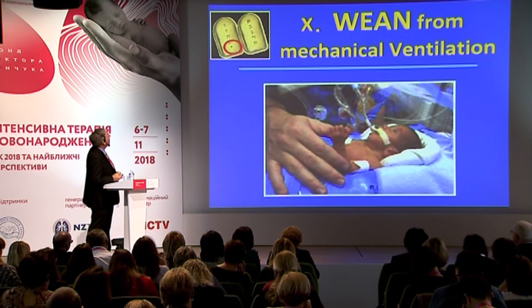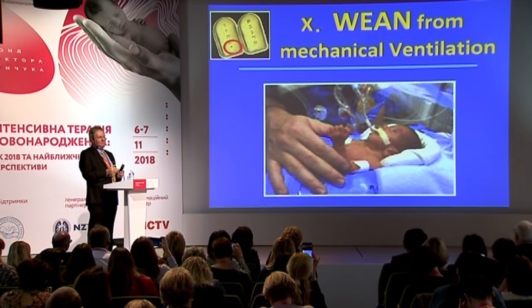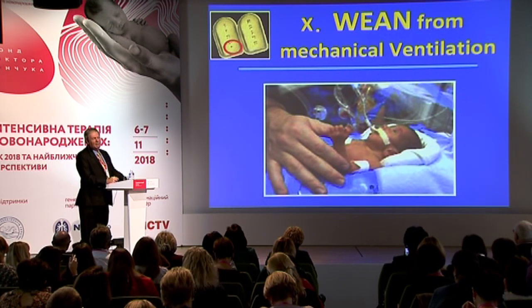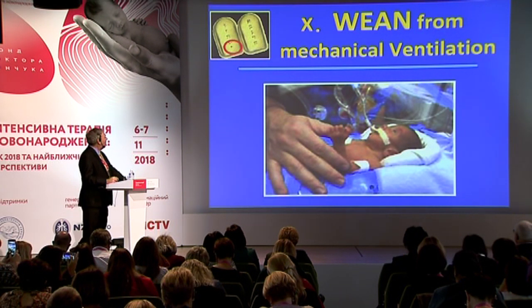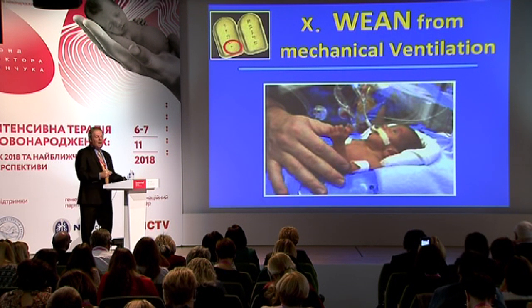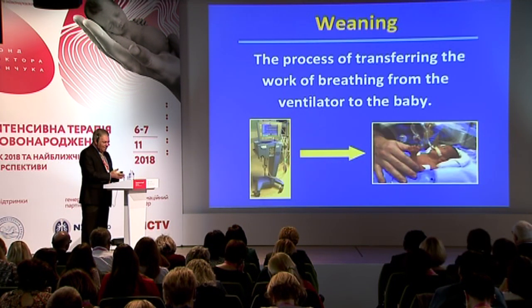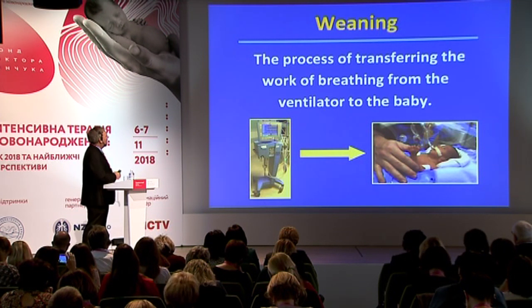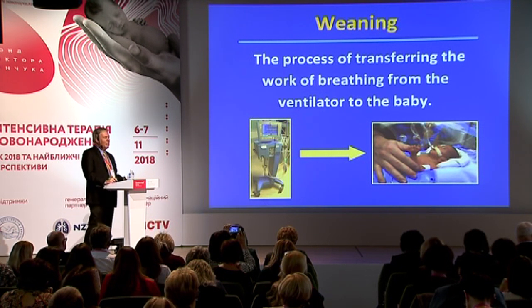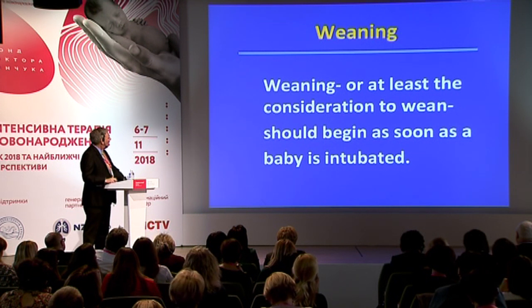And finally, the last commandment, wean from mechanical ventilation. I think all too often we get too complacent. We put the baby on the ventilator, things are going really well, and we're very reluctant to want to decrease the level of support. But if you think about weaning, what is weaning? It's a process in which we transfer the work of breathing from the ventilator to the baby.